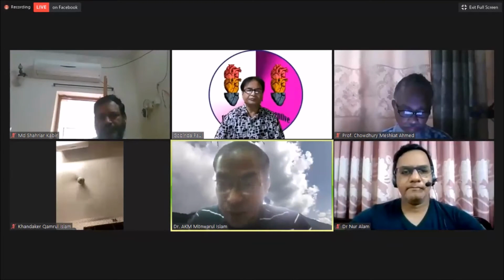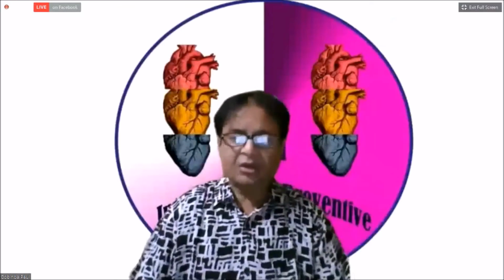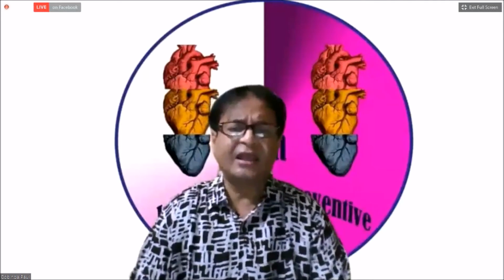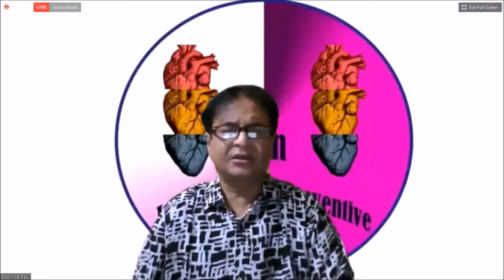Dr. Rehan has asked how left bundle branch block in DCM can be evaluated by M-mode. How can left bundle branch block in dilated cardiomyopathy be evaluated by M-mode echocardiography? In M-mode echocardiography, there is dyssynchrony of the interventricular septum and posterior wall. I have already shown one of the slides. There is LV dyssynchrony between the interventricular septum and the posterior wall. Then we can assess it, and ECG can also guide in that case.